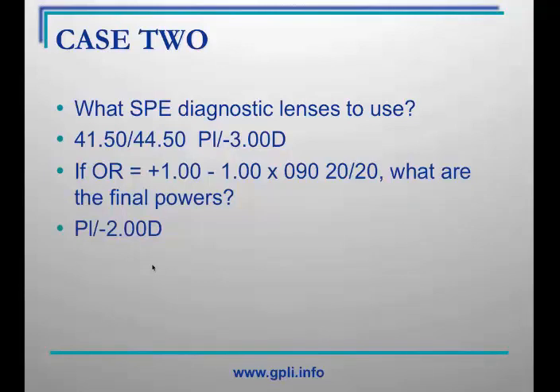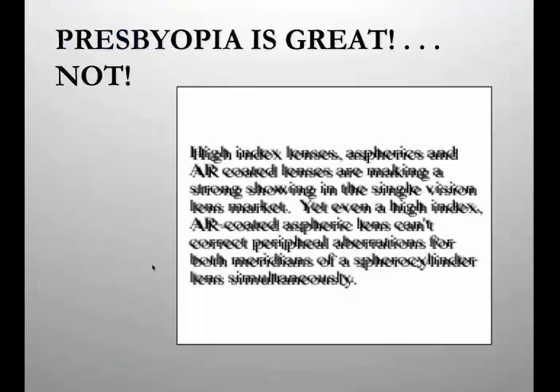So there you have bitorics. So let's finish with the wonderful world of presbyopia. One day print looks wonderful, the next day you wake up and print looks like this. Having been presbyopic for a long time, I can remember when it seemed like it happened overnight, even though all our accommodation rules and books tell us that that actually isn't the case. Regardless, it absolutely is not enjoyable. But the good news is we have some outstanding options to fit the presbyope.